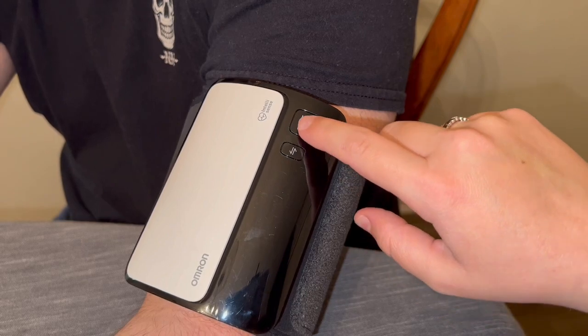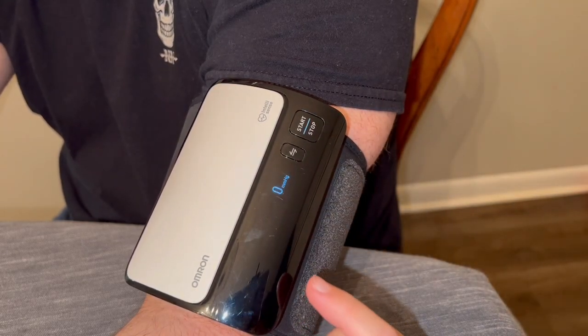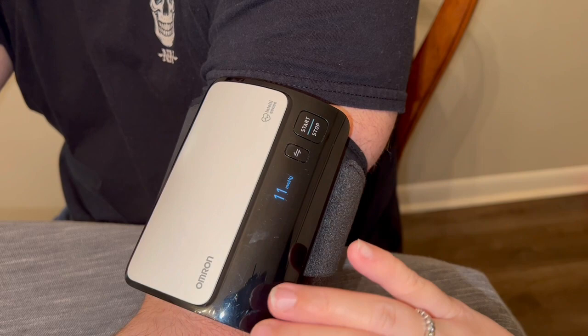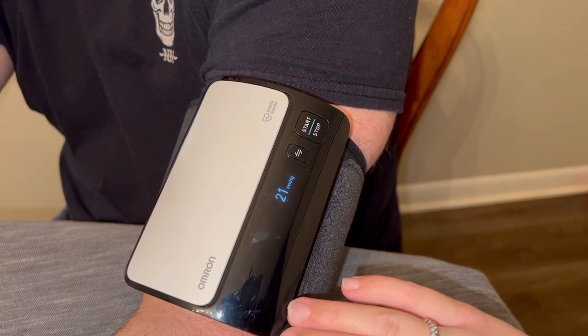I'm going to go ahead and start this and just talk about the different features as it's going. What's nice about it is that all you have to do is press start — it automatically comes on. It's cordless, portable, and all it takes is four AAA batteries in order for it to operate.